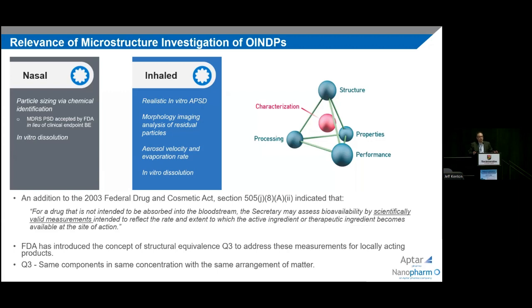I think it's been a huge success, and as you can see, there are 6 product-specific guidances specifically for nasal sprays which incorporate MDRS, and I think it has unlocked the potential for the nasal spray area.